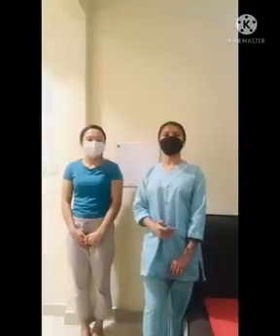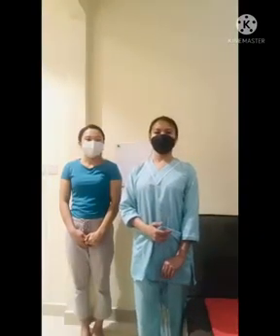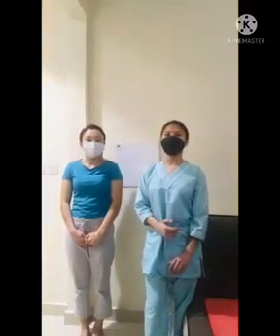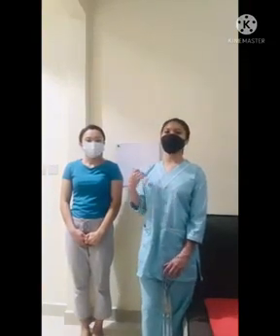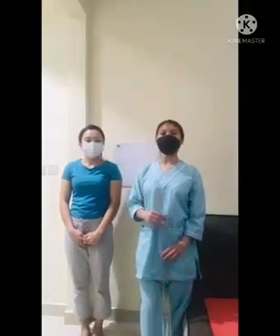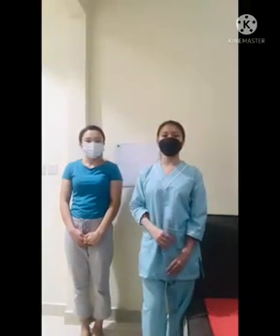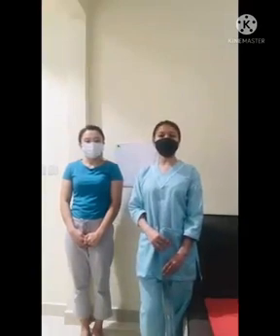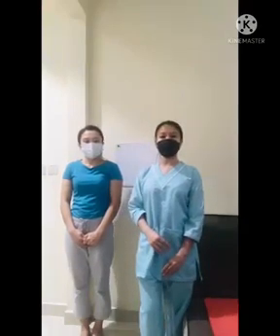Okay. Glenoid cavity, AP oblique projection, Grashey method, and we're going to use the image receptor, which is 10 by 12, our secondary marker, and we're going to use the meter stick. So, the glenoid cavity is AP oblique projection, RPO or LPO position, Apple method.